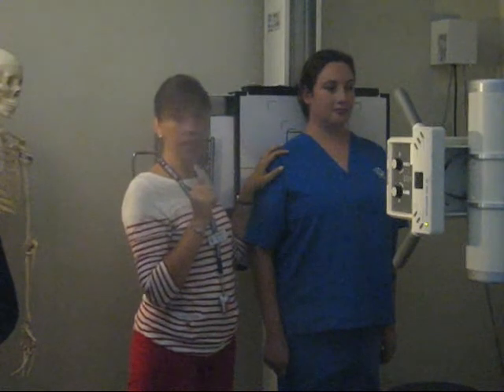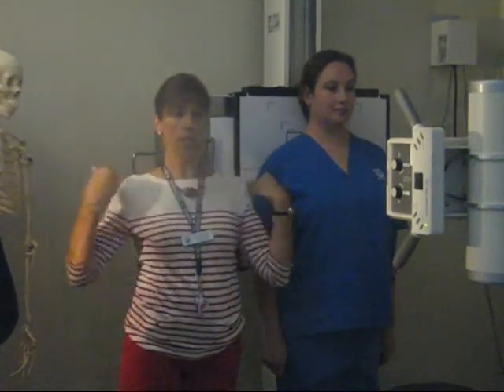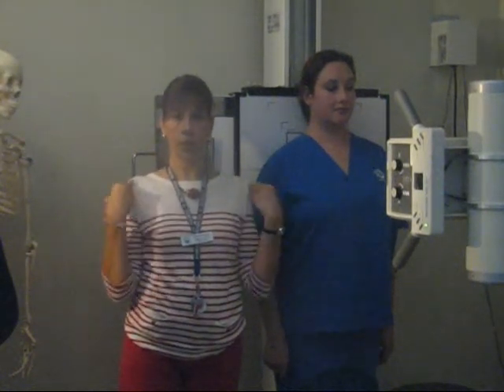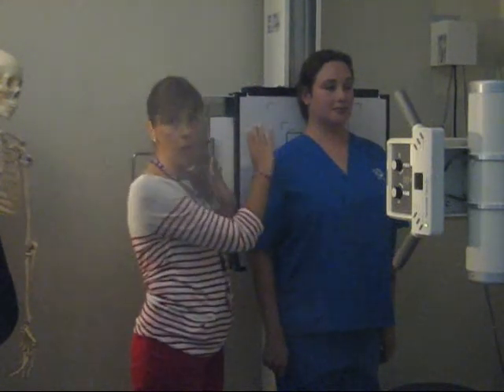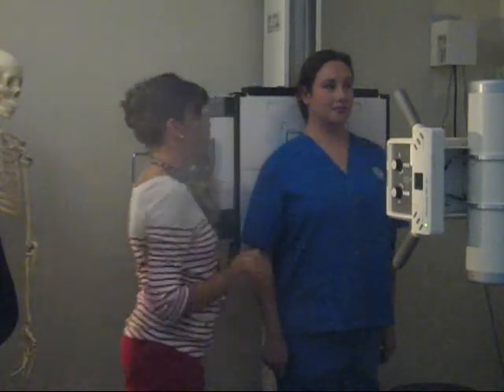In some cases, if the doctor wants a complete view of the entire both sides uninterrupted, you could use a 14 by 17 crosswise, and hopefully would get most of everything.